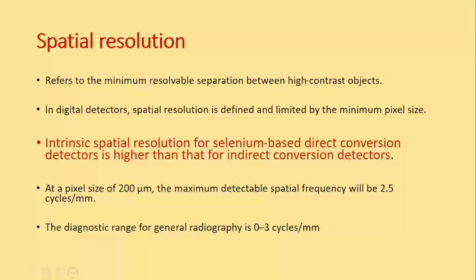spatial resolution, if you go back to 2D, since you're comparing 2D and 3D here, way back in dental school, I'm sure somebody taught you about something called line pairs per mm. If I recollect my days of math in school, you had that small tiny graph sheet, the 1 square centimeter, and within which again you had those 1 mm lines.